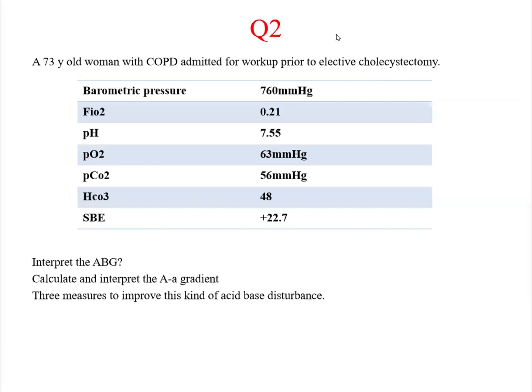I got something in the chat box: it's metabolic alkalosis with respiratory compensation.